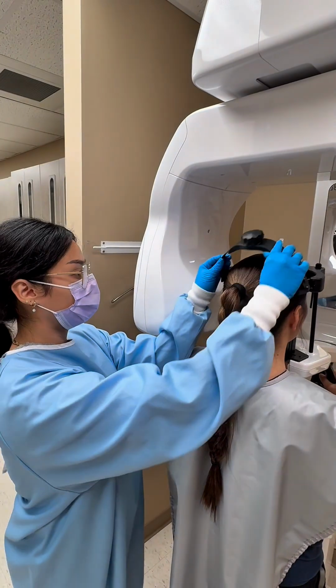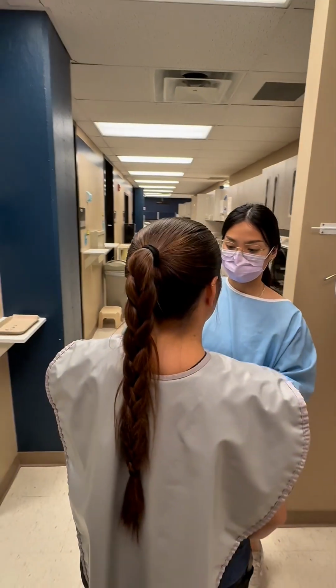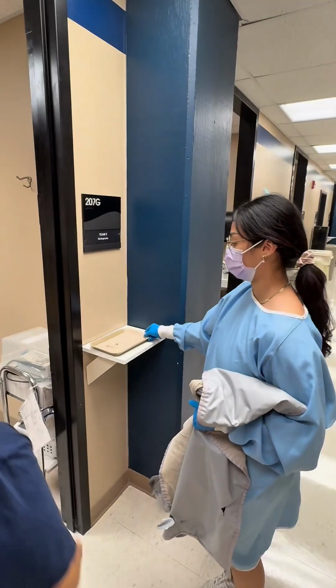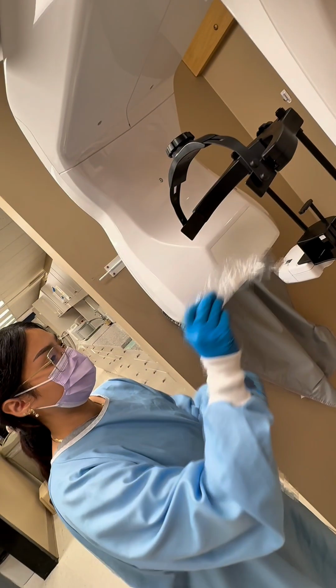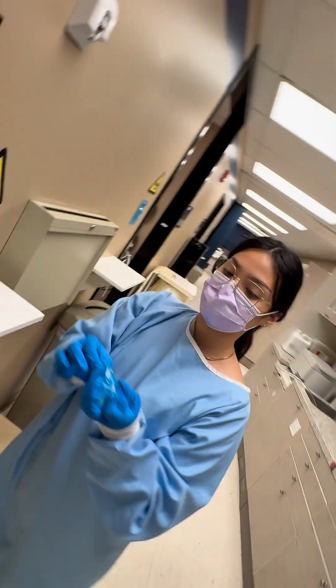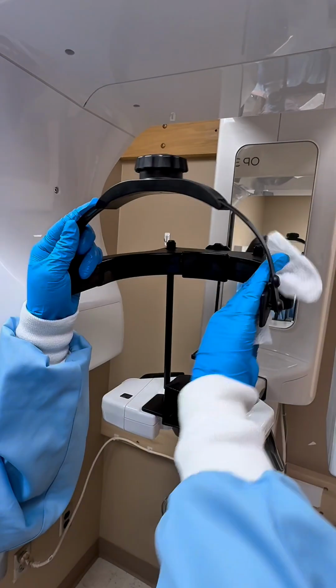Once the exposure is complete, release the forehead and temple supports, back the patient out of the unit, and remove the lead apron. Return the patient's personal items back to them, and make sure to thank them for their cooperation. Don gloves or remove overgloves to remove any plastic barriers used. Disinfect handrails, mirror, keypad, exposure button, and lead apron.